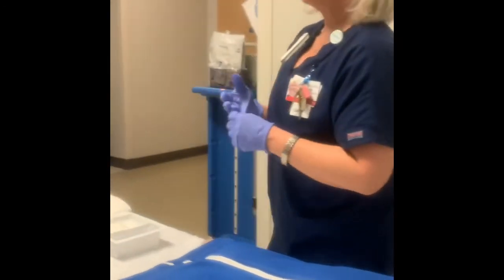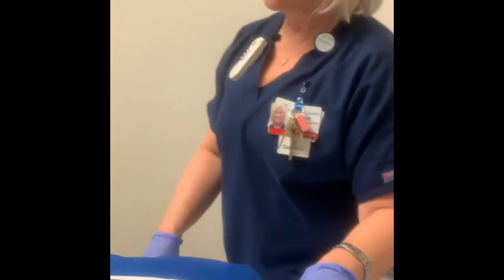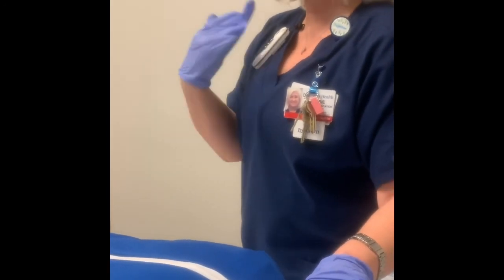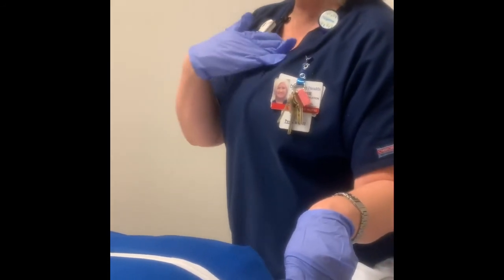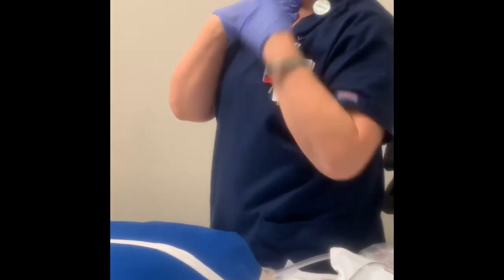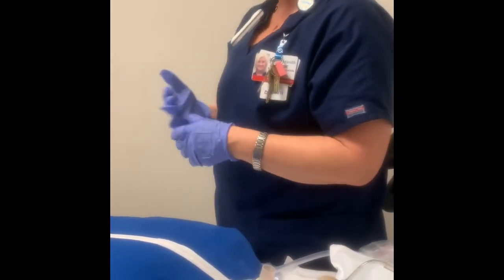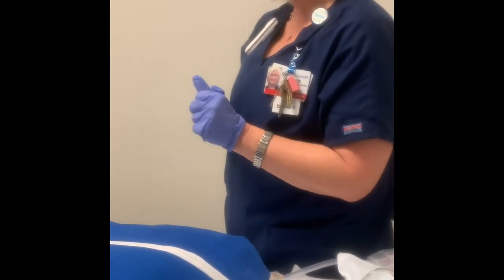So they can have those too, but if they also want to talk, they have talking trachs. They have many different types of trachs, fenestrated trachs. You have tons. It depends what they're wanting to use it for. So they'll cap them so they can talk. Because remember, your trachea is here, your larynx is here. So the air's coming out here, you can't talk because nothing's vibrating the vocal cords. So they'll cap it so they can talk. And they can breathe fine, but they still have to have the trach in the event that they need it. So there's many different types of trachs out there. It just depends what you're going to use it for.